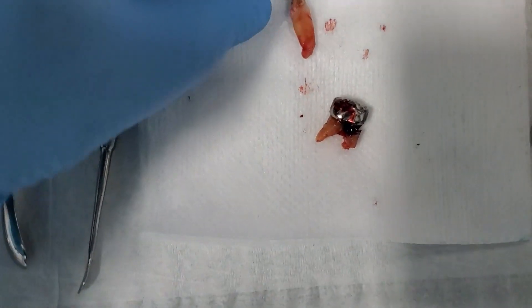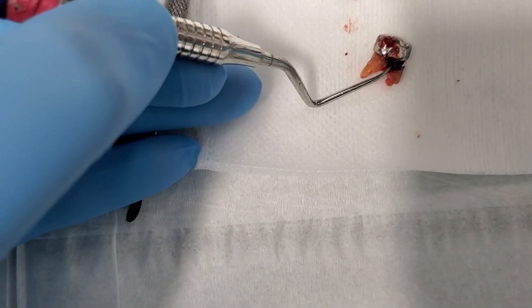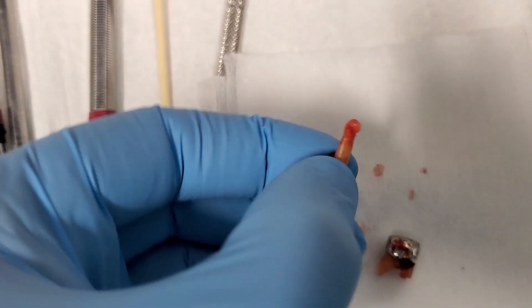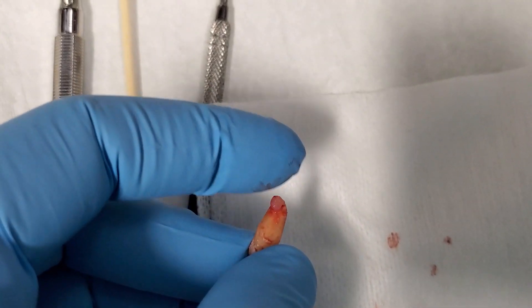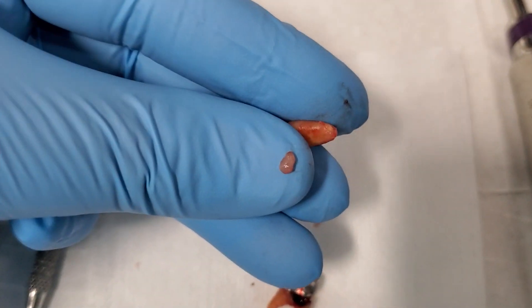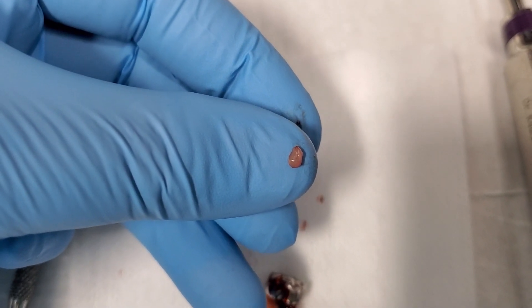That's what infection looks like on the x-ray. This patient already had the tooth removed, and this is the infection — the cavity that caused the infection on the baby tooth removed on the left side. But the other tooth had this big glob of infection, as you can see here. I pull the infection out in my hand. As you can see, this came out from the end of the root — this is the big glob of infection that was sitting at the end of the root of the tooth.